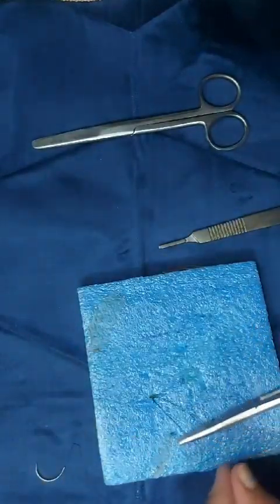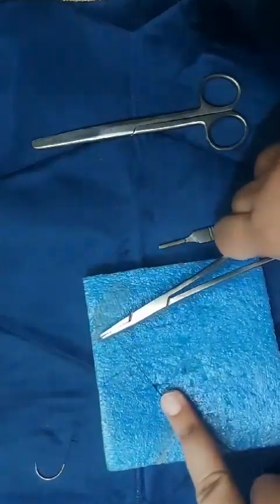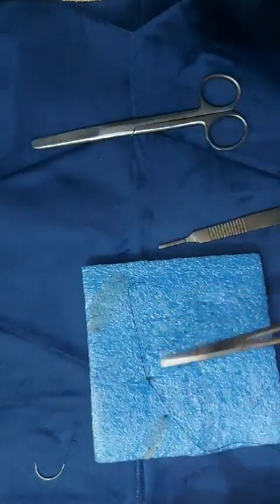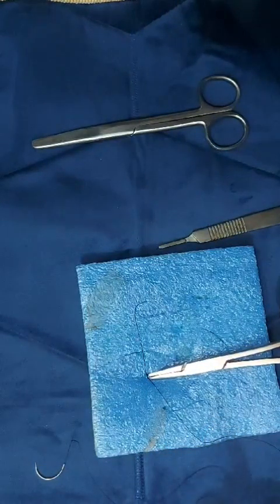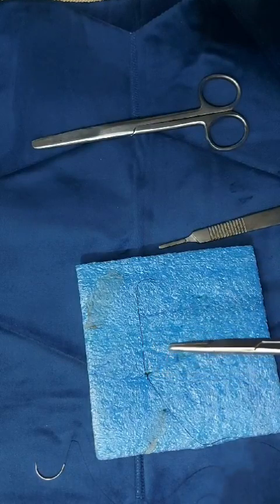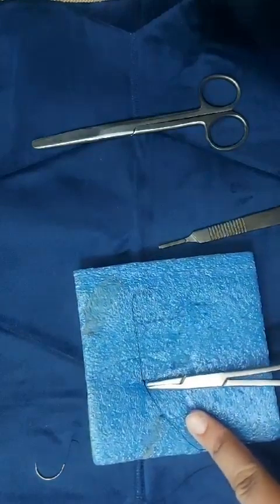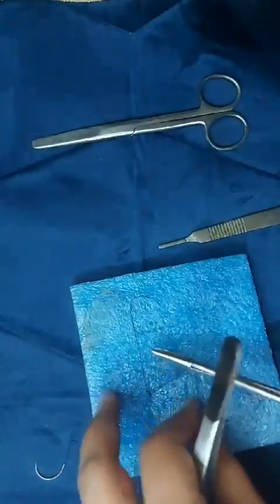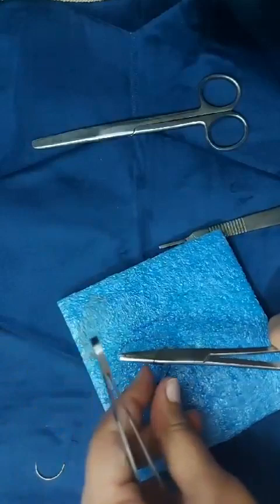It's called a throw, and then again tie a knot in the opposite direction, and then pull the two lines across the wound in opposite directions. This is called a throw, and don't position the knot directly over the wound. It should be at the side of the wound, and then we can make two or three throws over a knot.